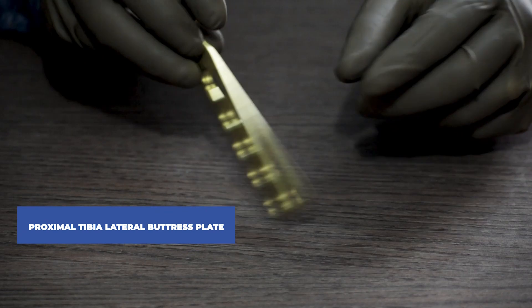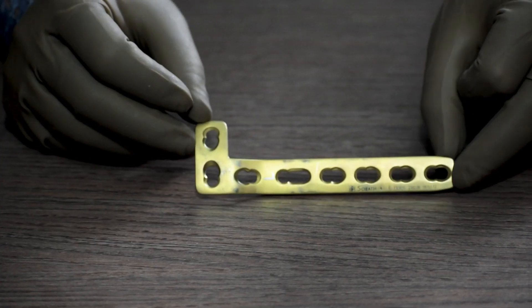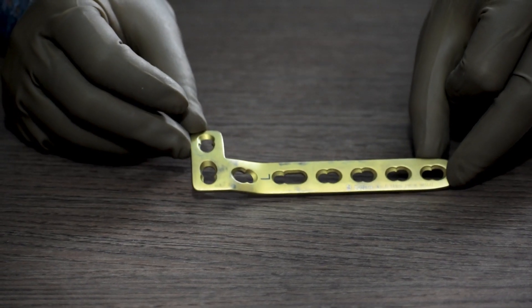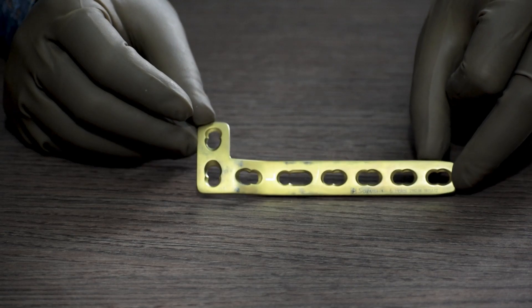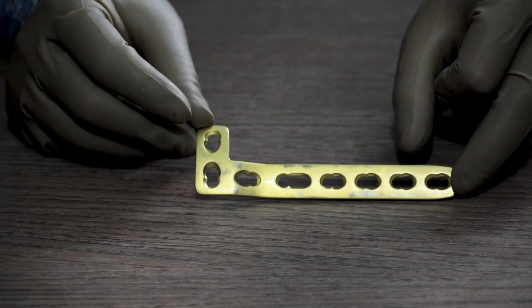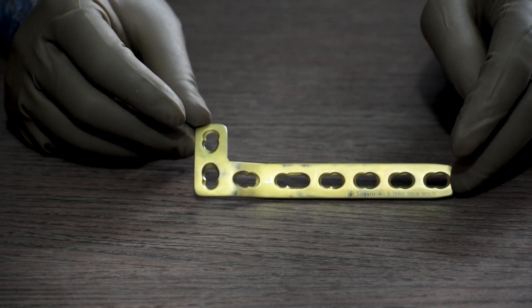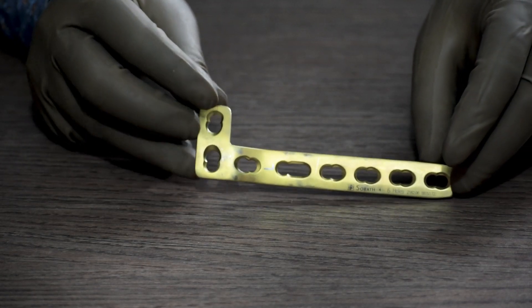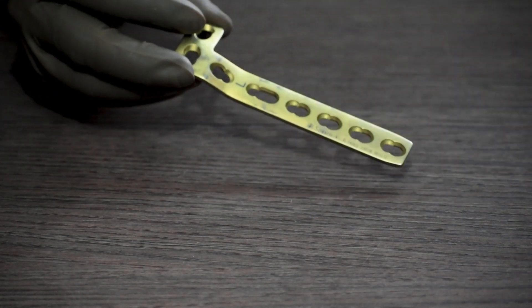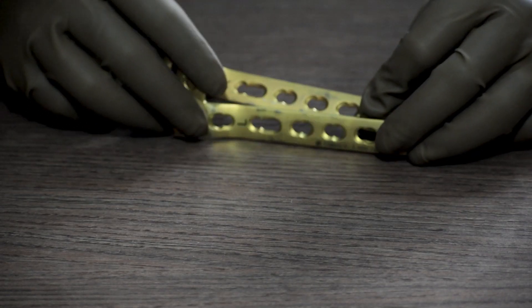Next is the proximal tibia lateral buttress plate. This can be fixed in the middle as well as the lateral side of tibia. It is also a 4.5 system available in different sizes starting from 4 holes till 10 holes with 2 holes gap in between: 4 hole, 6 hole, 8 hole, 10 hole. This is a side specific plate, available in left and right side.